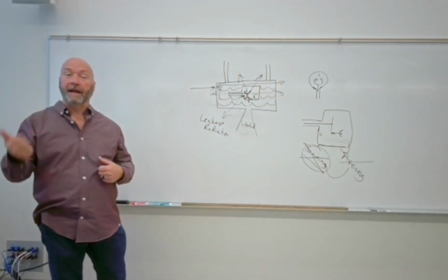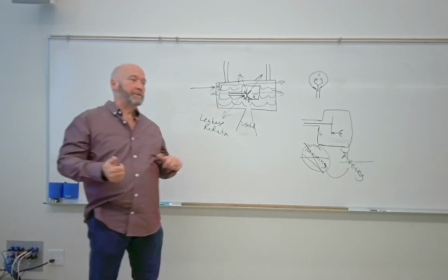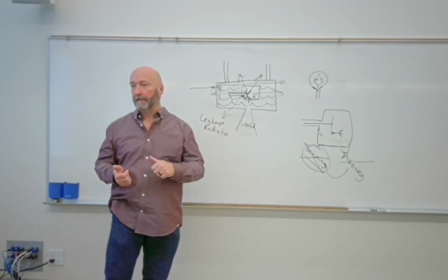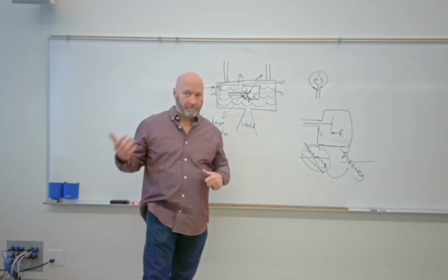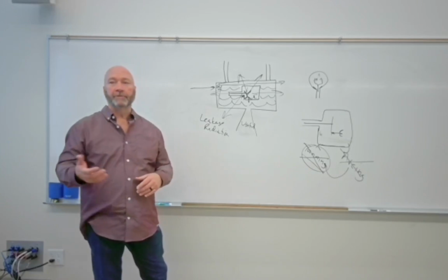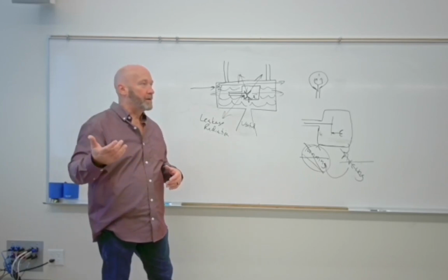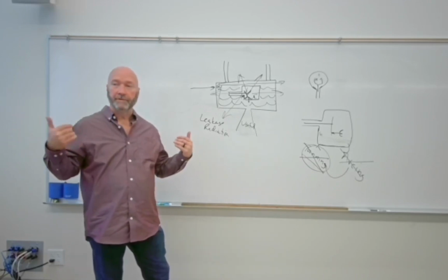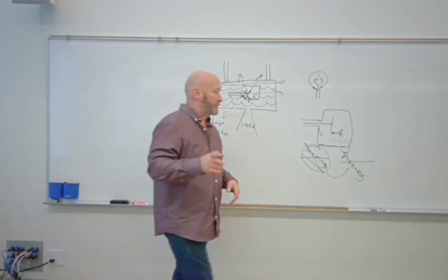One is what we refer to as inherent filtration. Inherent filtration for our purposes is going to be filtration that you have to have in order to make an exposure on a human being. So that's 2.5 millimeters of aluminum. You can't make a diagnostic exposure without it. Added filtration will be anything above 2.5. So if we were to use a scoliosis series, we talked about the trough filters that they might use for scoliosis. That's added filtration.